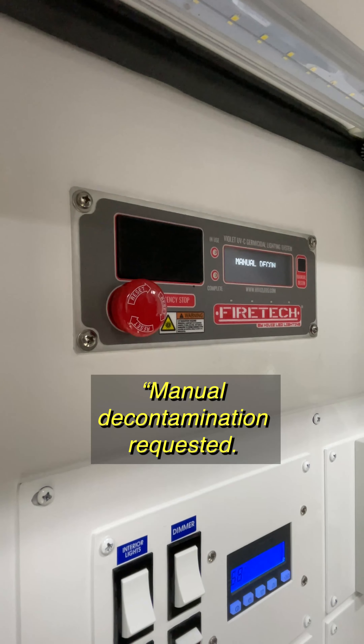There are also motion sensors, so if the system detects that somebody's back here, it will not turn on. And if the door opens during a decon, that will kill the system as well. So overall, it's just a really easy, simple way to decon the unit that's hands-free.